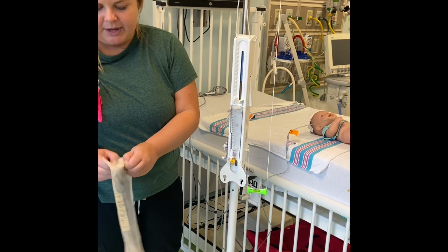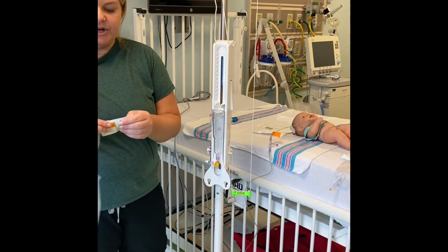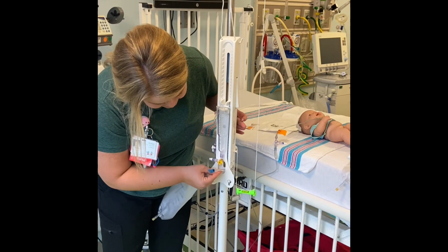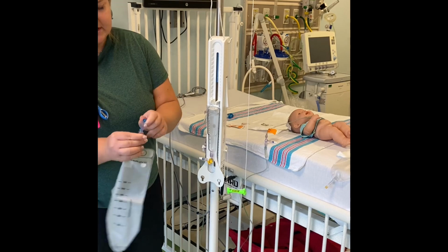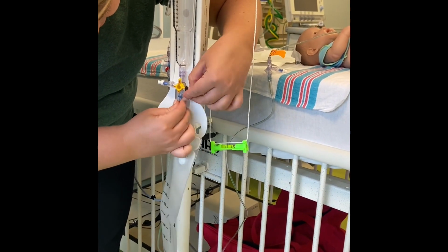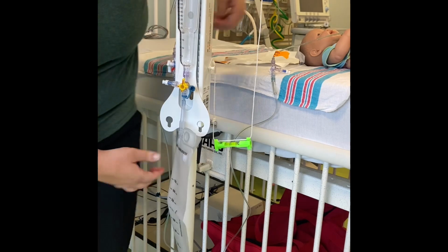We're going to open our EVD bag and have this ready. We then can take our site scrub or our alcohol wipe. We're going to wipe the site. Twist the top of the blue cap off. Line this up. And make sure it's twisted on there nice and tight.